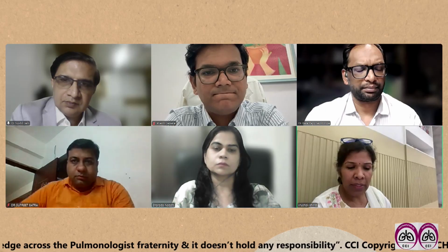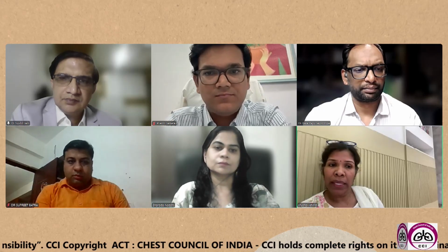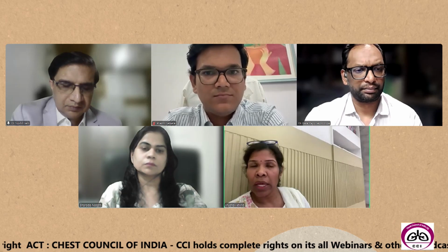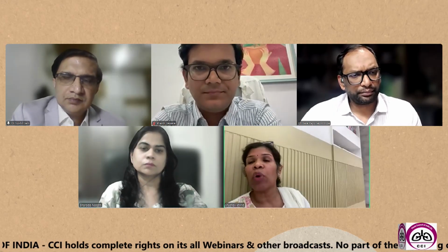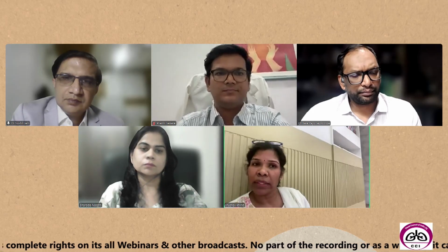And the other thing is, with the PET CT you can see the uptake of the lymph node. So it's like you just mentioned, the distinct margin, the size. It's also shown that when you have a PET along with a CT, the biopsy yield goes up to 93% vis-a-vis 79% when using only a CT scan. With a PET, you can also see some bronchial lesions which you might want to sample at the same time. So it gives you a wholesome picture as to which are the various stations you can sample.